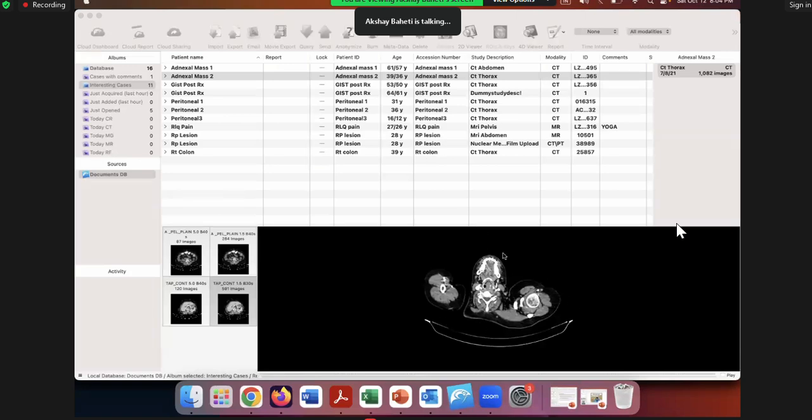Yeah, so Bhumika wrote this, entrapped ovarian cyst. That's the perfect term, right? So the ovary is entrapped and secretes fluid, and it gets stuck. So that's the peritoneal inclusion cyst.